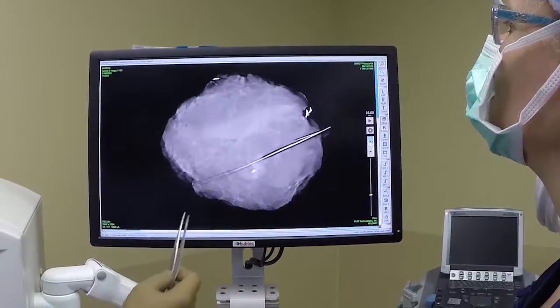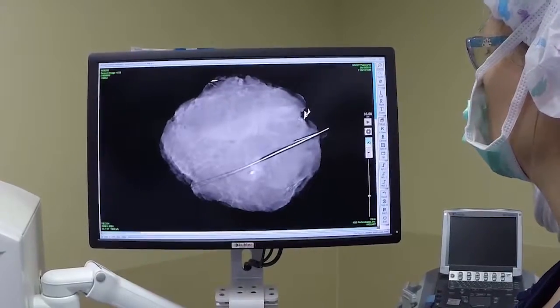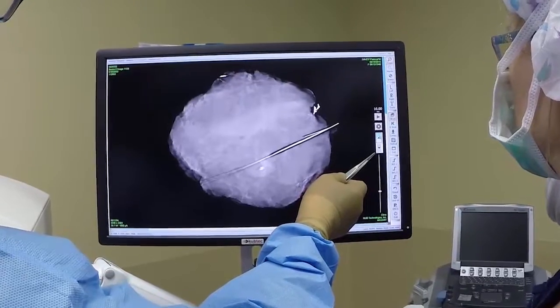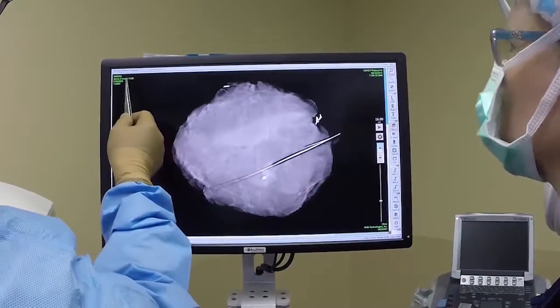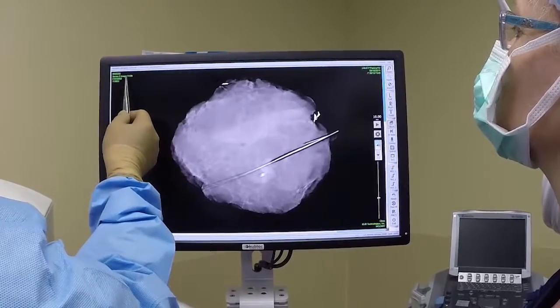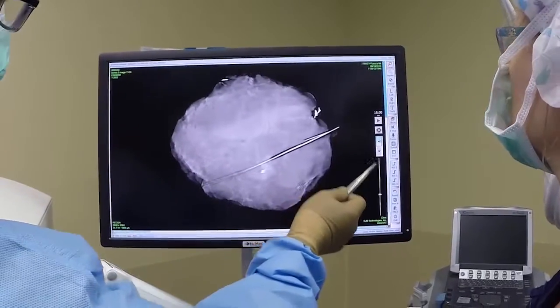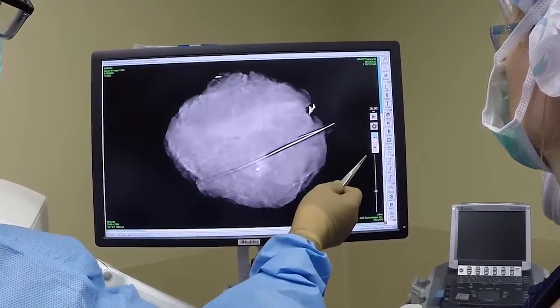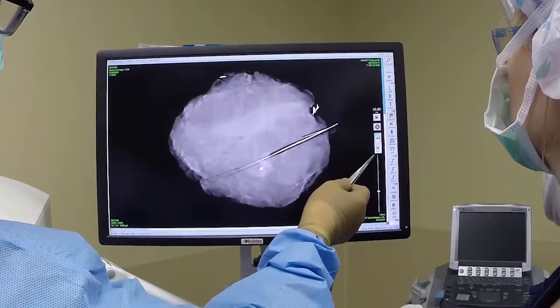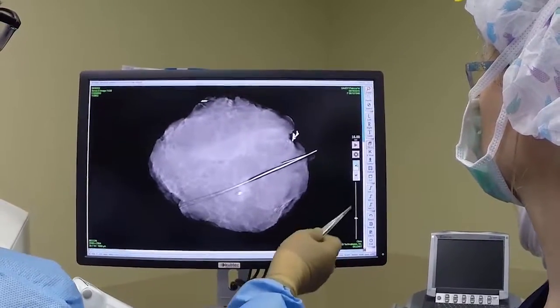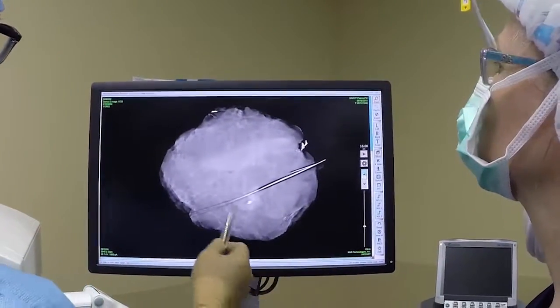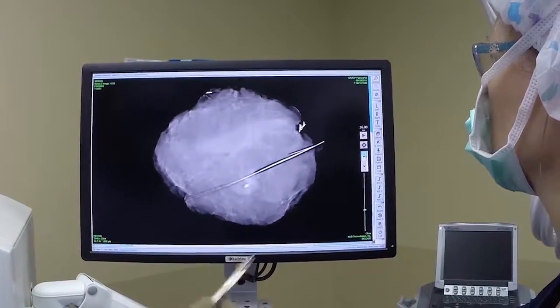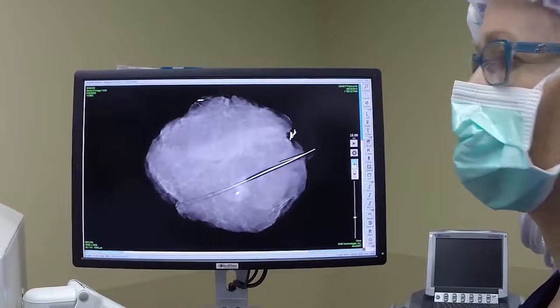It's at 16 millimeters from the edge, from the deep part. And you can see on here, this is the depth of it, and this is the most superficial — that's at 25. This is slice 11 out of 28 pictures, so it's 28 millimeters here. This is the base, and this is the most superficial spot where the laser was. We're at 16 millimeters from the base, which is right about in the middle of the tissue. And then in a minute I'll target it. But that's the one we're going to send to PAX.